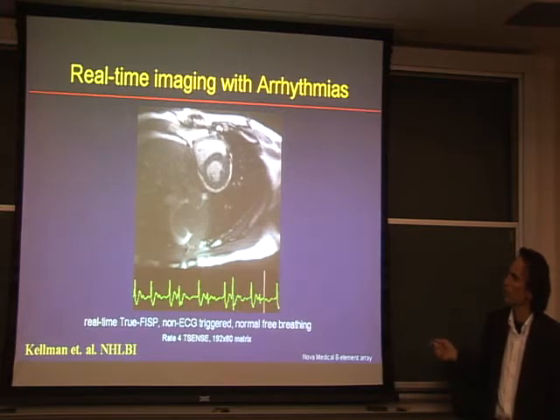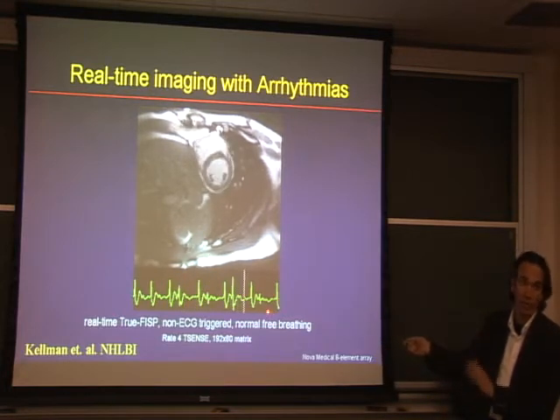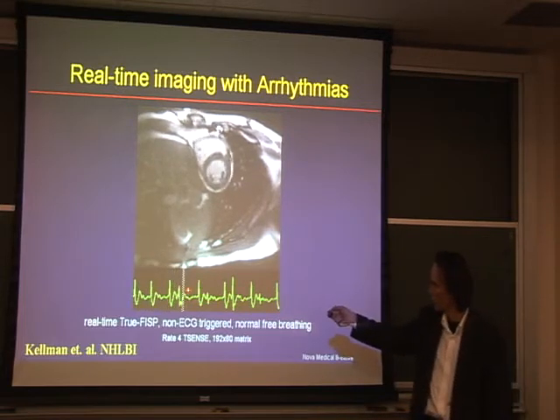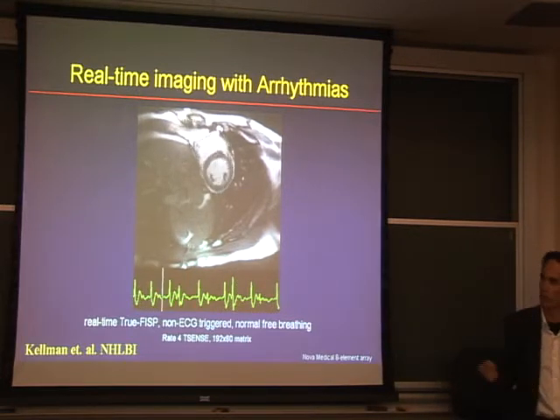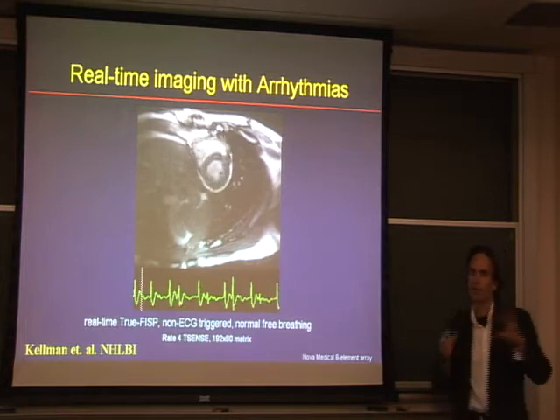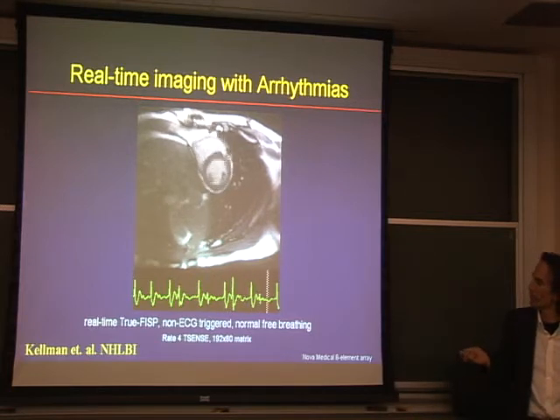The interesting thing, and what we're looking at more now, is that as soon as the patient gets in there, you just start taking data. Take the EKG, good enough, take these pictures. They're not super high quality, but then use this EKG to take the echoes and re-bin them together to make really pretty pictures in retrospect. If you've got, say, 100 heartbeats, you go through those 100 heartbeats, take the best data out of all of them, and make one nice movie. That's the philosophy.